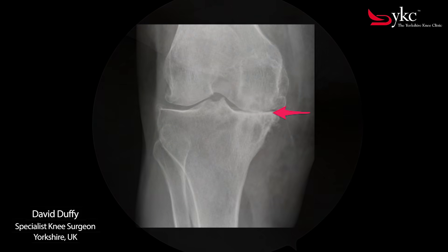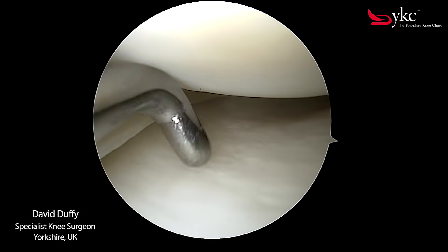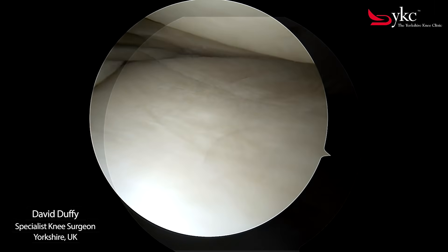This x-ray shows that the arthritis is severe and the cartilage is worn away down to bone. No gap now exists between the femur and tibia, highlighted by the arrow. The difference between a normal healthy knee, as shown here, and one with arthritis is very clear and stark.